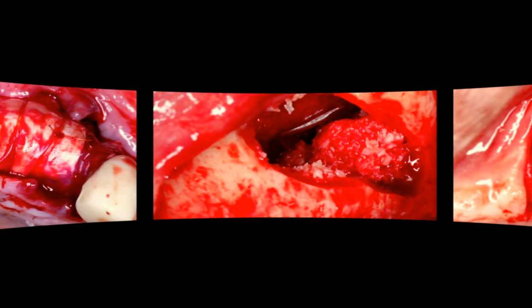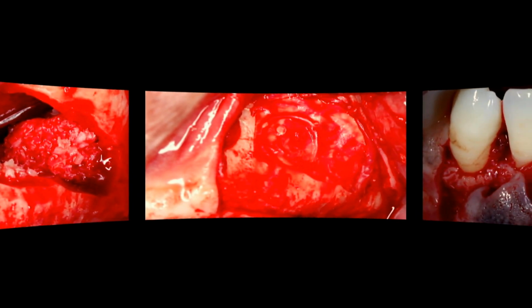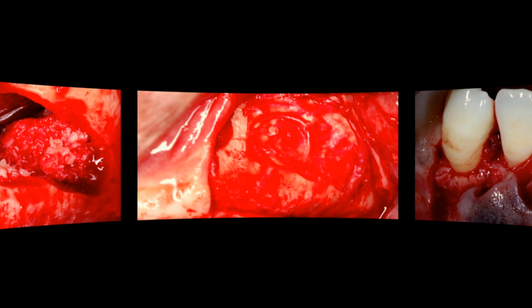I mentioned this already, lateral wall sinus lifts, perforations do occur. As precise as we want to be in using our piezos, it's still very possible to get a perforation. This is a very simple way to repair that, especially for the small perforations. Lateral windows, of course, covering that lateral window with an Amnion-Chorion membrane works really, really well. It conforms beautifully to the defect.